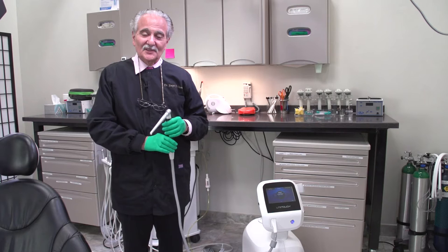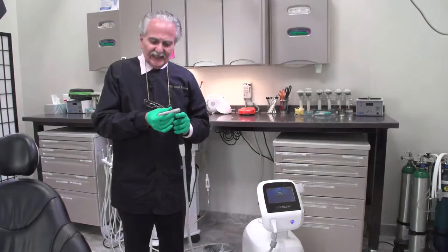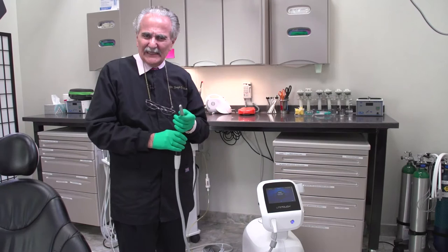Hi, I'm Joe Masada and this is another tip of the day. I recently got a new laser called the Light Touch. What I really like about it is it has its own water supply, it works on both hard and soft tissue, and it has multiple different tips. Right now I have a tip on for hard tissue.